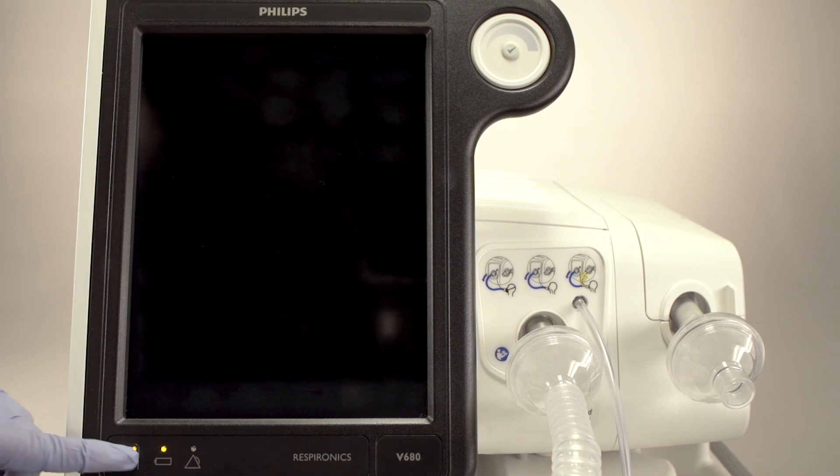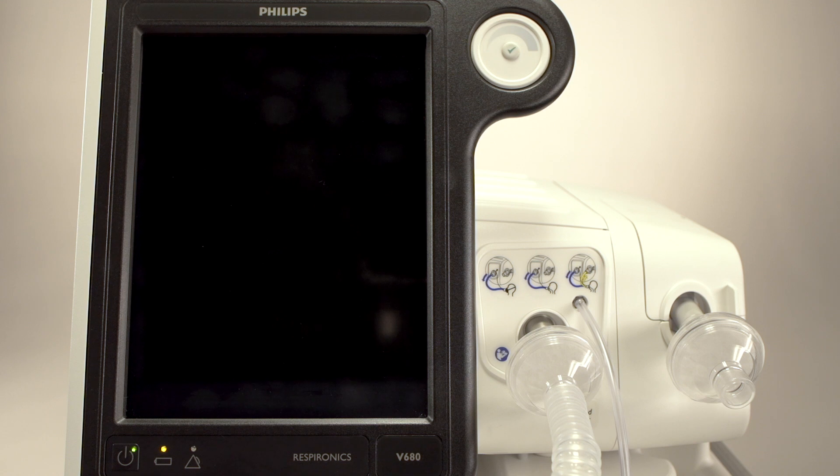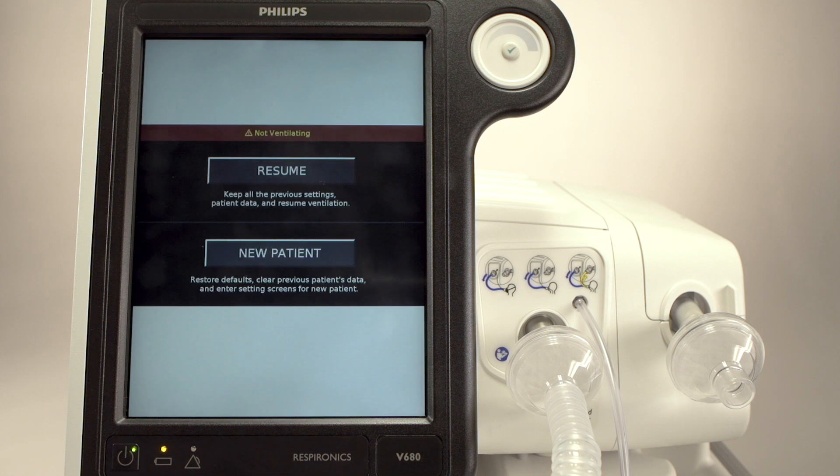Now we will power up the unit. Touch the Power button. V680 first enters into a Power On self-test to check functionality in alarms. Note that the audible alarm gets progressively louder.